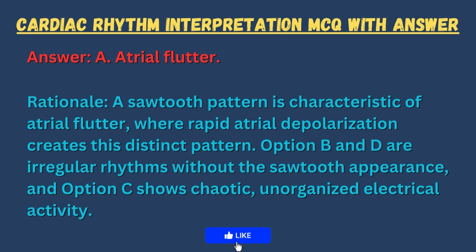Answer: A. Atrial flutter. Rationale: A sawtooth pattern is characteristic of atrial flutter, where rapid atrial depolarization creates this distinct pattern. Options B and D are irregular rhythms without the sawtooth appearance, and option C shows chaotic, unorganized electrical activity.